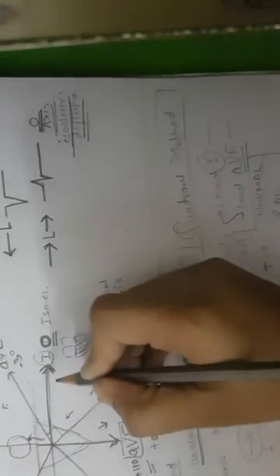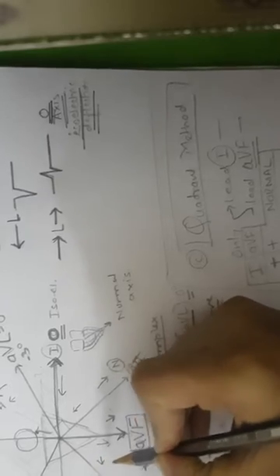If the QRS complex is negative in lead 1 and AVF is positive, the current is flowing in this direction, which means the cardiac axis is on the right side, so there is right axis deviation, because it is going away from lead 1.